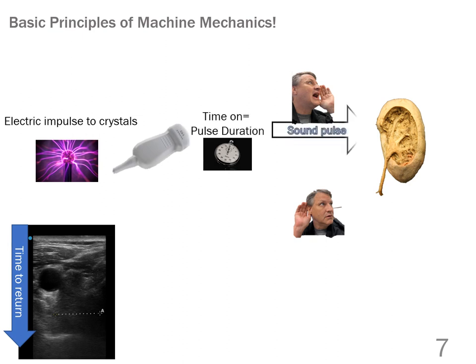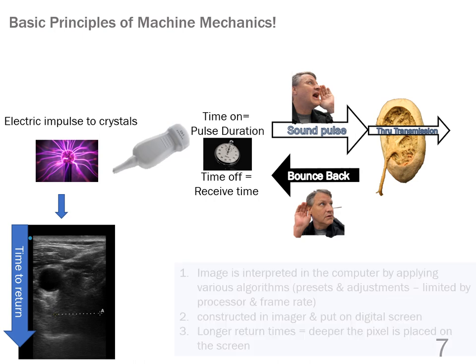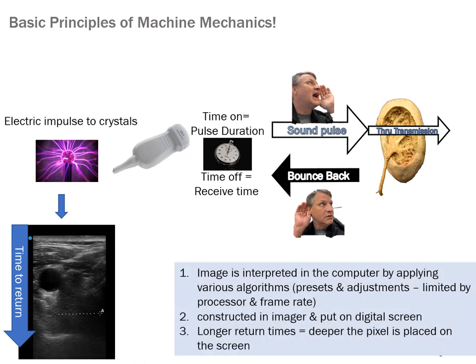Let's think about how the machine is producing a picture, those little gray pictures that we've all seen on, let's say, the sonogram that's done on an early pregnancy. We start out with an electrical impulse that's fired through a probe, which fires crystals to produce sound. And then there'll be a pulse time on as that sound goes through the actual object, and it will hit an impedance change and bounce some sound back to the probe, where it will be turned back into an electrical impulse, and the time will be registered.